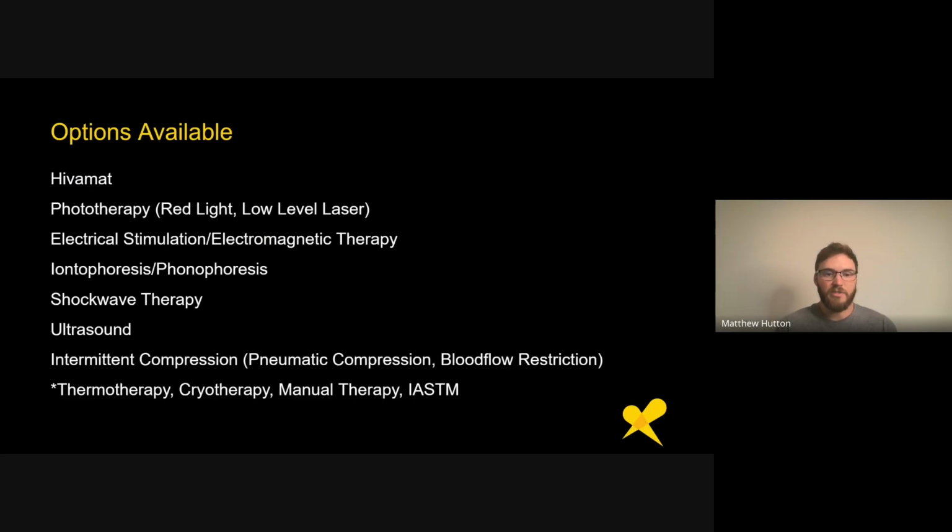Ultrasound, similar, I suppose, in application. The transducer is applying a sound wave that is, again, creating kind of micro vibrations that are going to stimulate different things based on where you're applying it. This sound wave is going to be absorbed differently by different tissues.